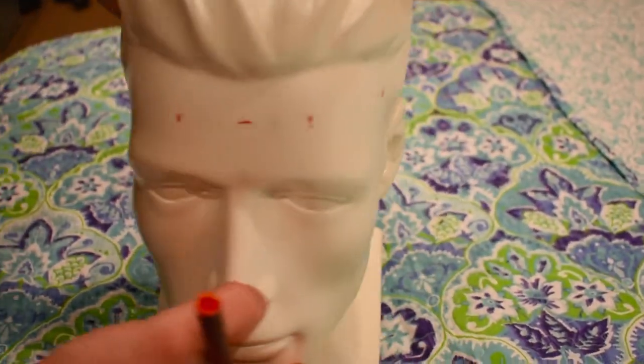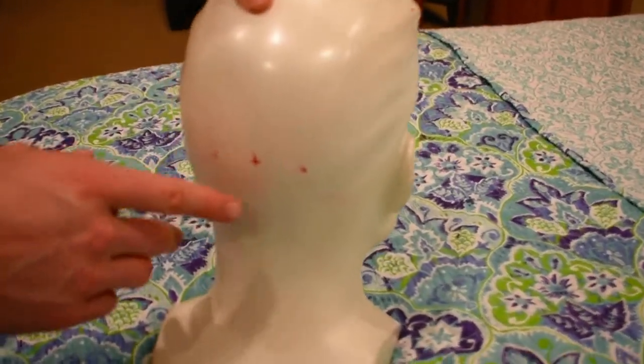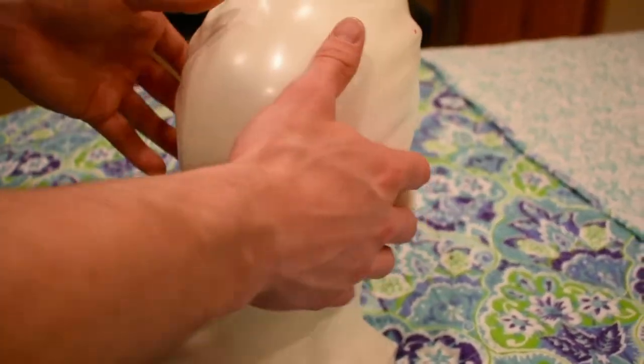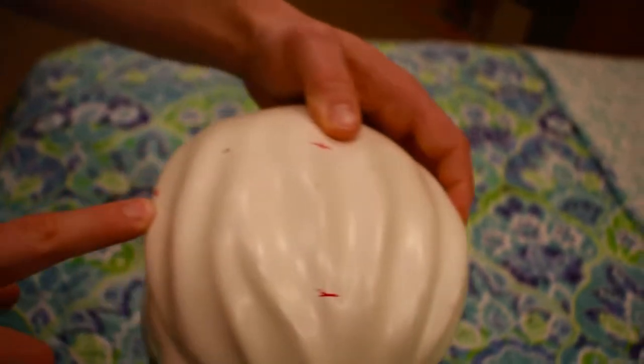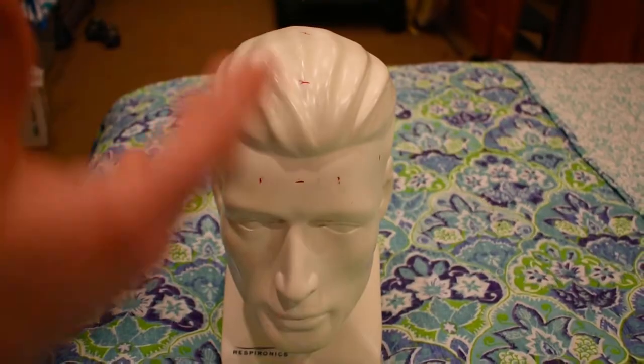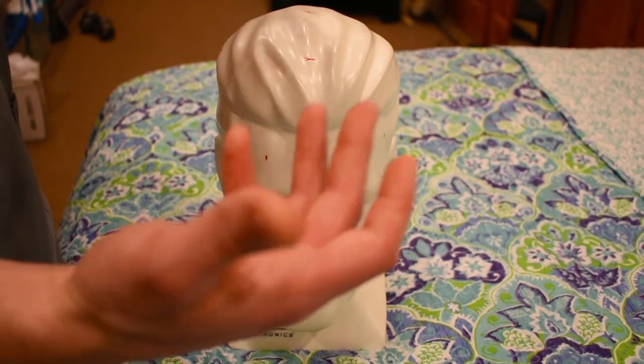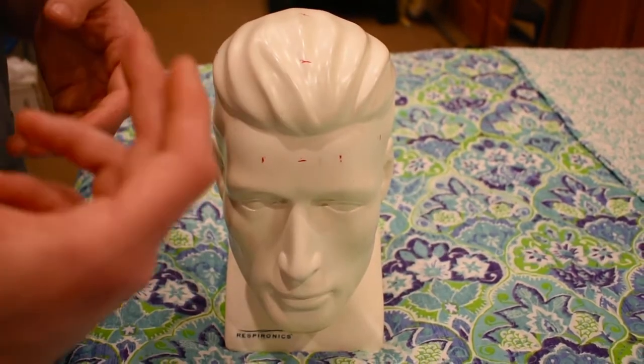Okay, so now we have preliminary markings for O1, O2, C3, and C4, and the last two exploring electrodes that we're trying to find here are F3 and F4 for the frontal lobes, which are going to be in the front of the head.